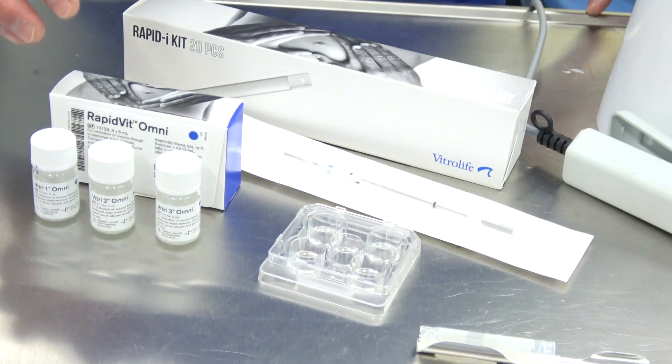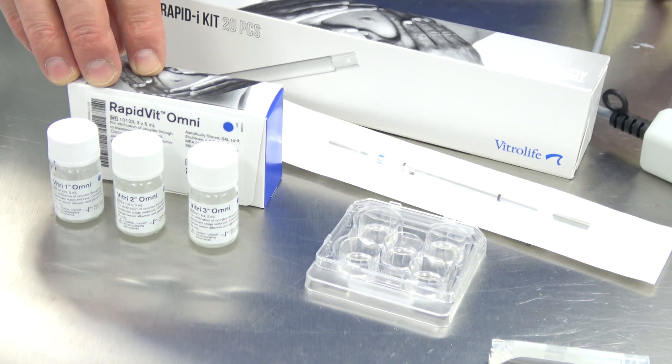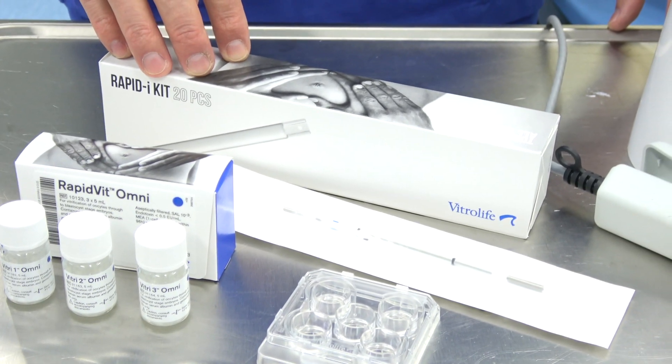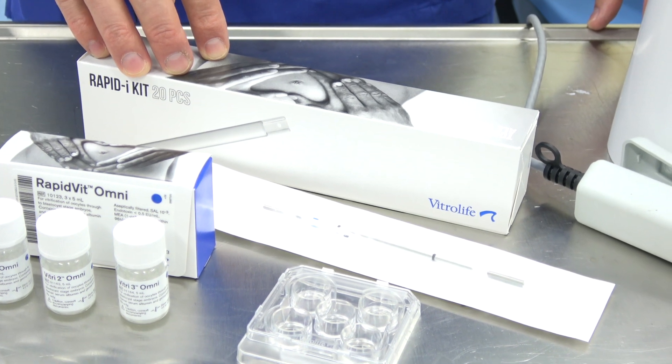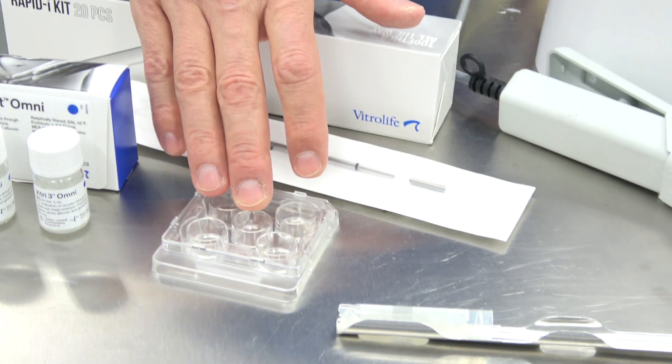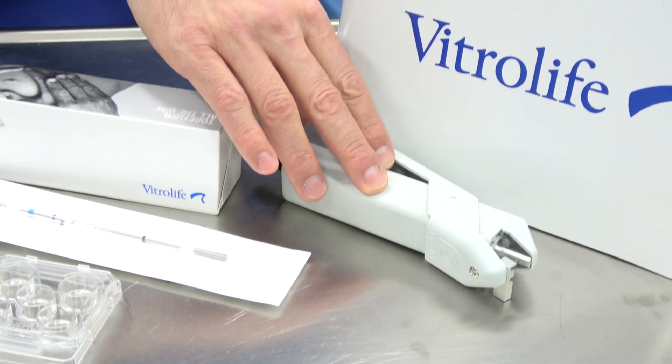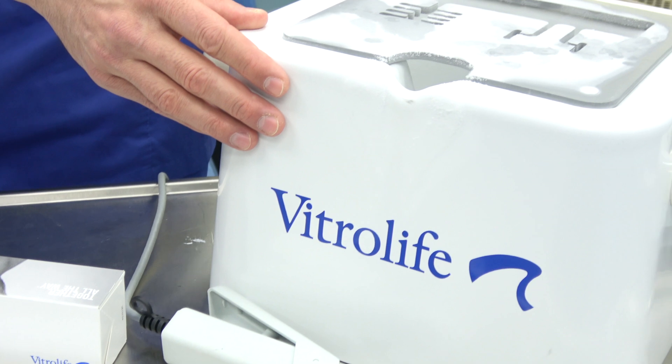In order to do the vitrification, we will make use of the RapidVit Omni kit consisting of three solutions, the Rapid-i kit consisting of the Rapid straw and the Rapid-i itself, the Vitrolife 5-well culture dish, the cryocane and goblet, the Rapid-i sealer, and the smart box containing the liquid nitrogen.